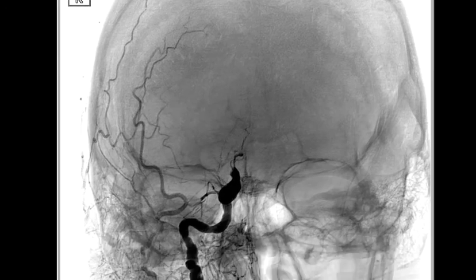I was told this case was very difficult. You can see the vessel irregularity. The vessel was difficult to open, and the clot is difficult to remove. It's stuck in there. The neurointerventionalist couldn't get the clot out, couldn't open it, and ballooned this area of plaque.